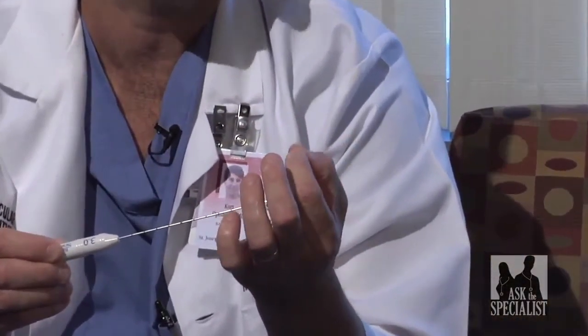And what ablation does is, this is an example of an ablation needle. With an ablation procedure, you heat a volume of tissue. So if you have a volume of tumor and you can put this needle into that volume of tumor, then you can expand the needle like that. I don't know if you can catch that on film. But what it does is it basically forms a sphere, and that sphere can then create a round area of heat greater than 60 degrees.